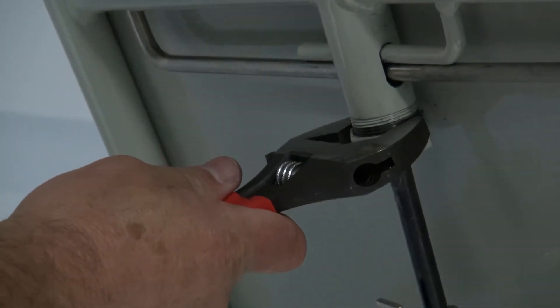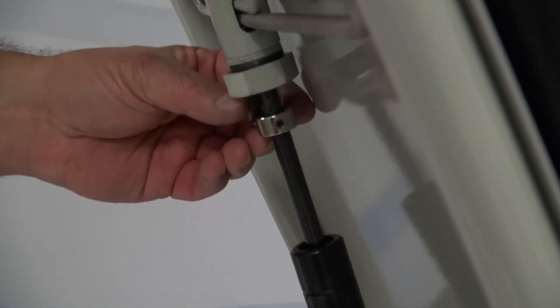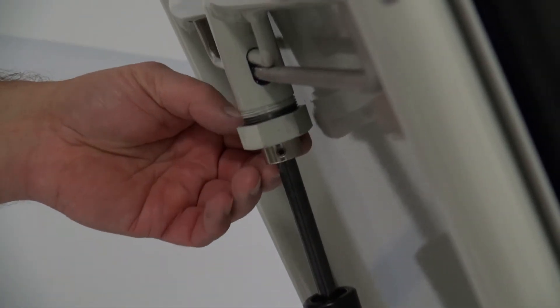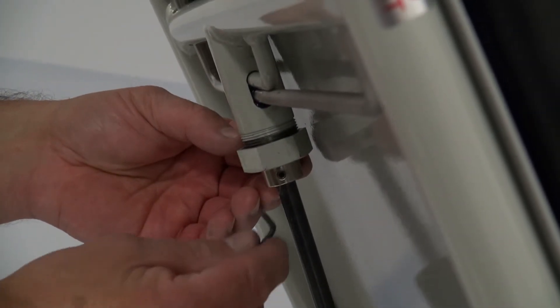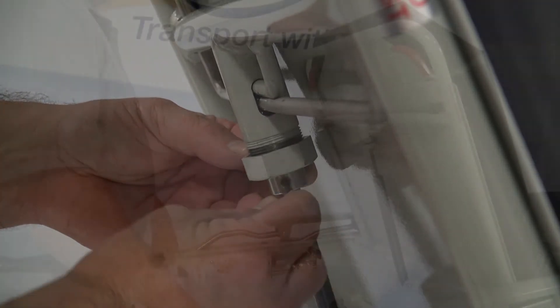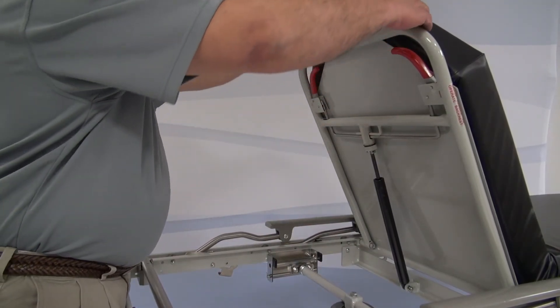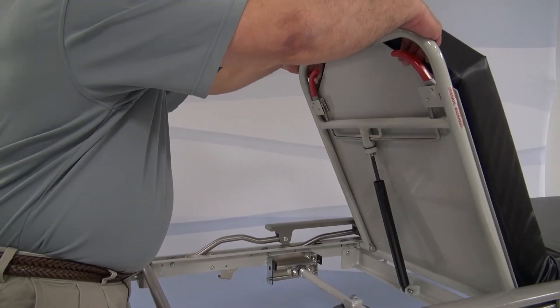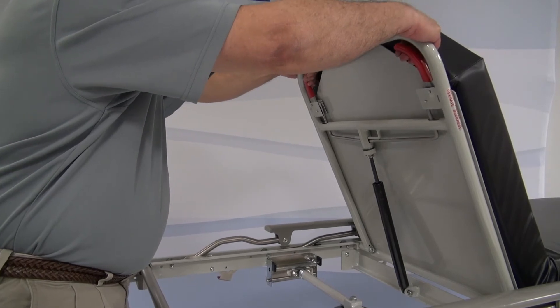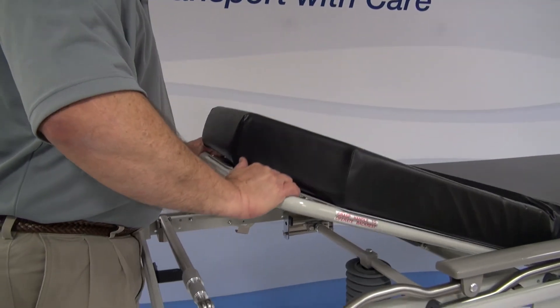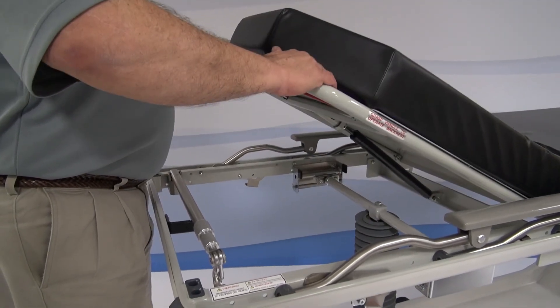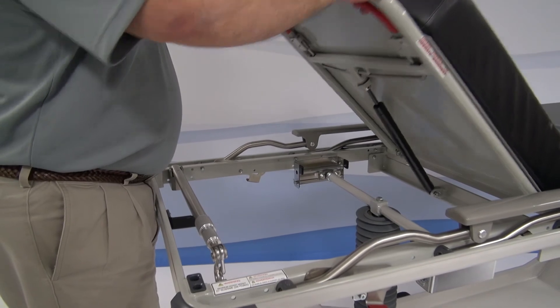Now tighten the gas spring nut and slide the stop collar in place and tighten the set screw. Try the red handle to see if they are working correctly. Your Hausted stretcher gas spring replacement procedure is now complete.